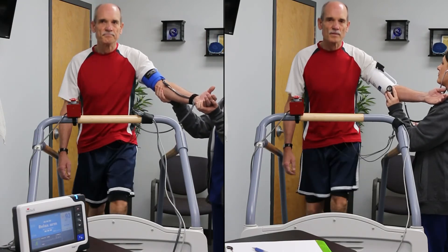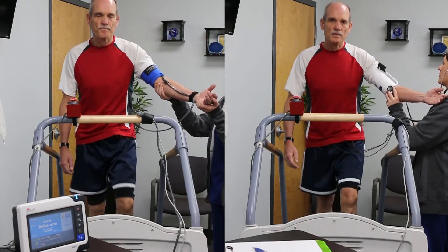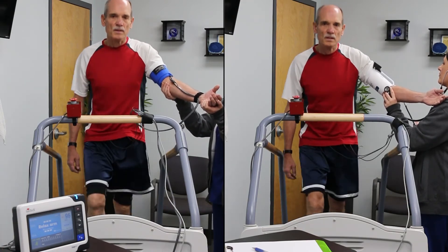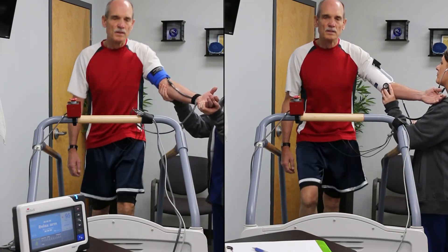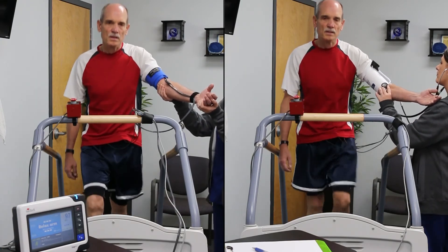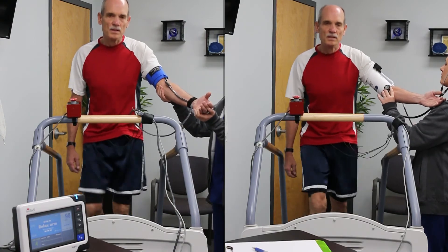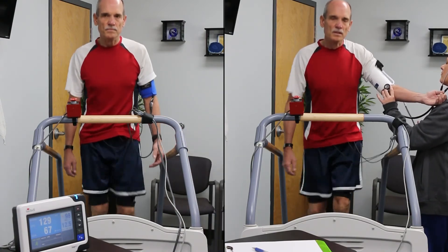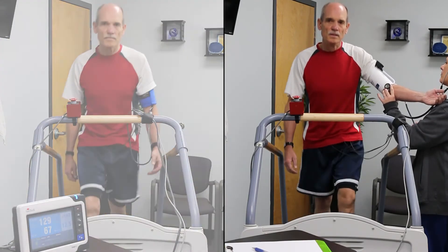With the Tango M2, you can see the K sounds displayed on the LCD screen. The Tango M2 uses the ECG signal to determine when to listen for the K sounds. When it has detected all of the K sounds in a particular BP measurement, it uses its proprietary DKA algorithm to determine the systolic and diastolic blood pressures.